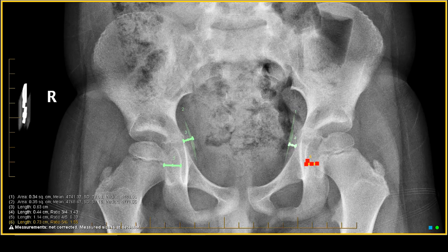So all that tells me is that there is a joint effusion on the right side. The increased sclerosis and the lucency tells me that there's a little bit of collapse happening. And these are the classic findings of Legg-Calvé-Perthes, or a form of avascular necrosis, if you will.